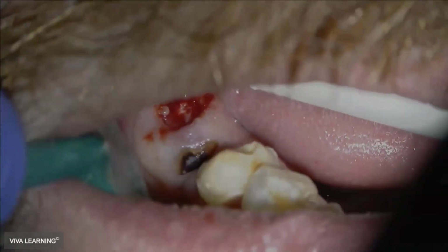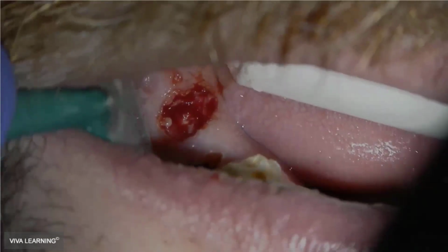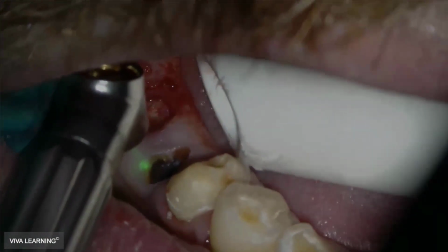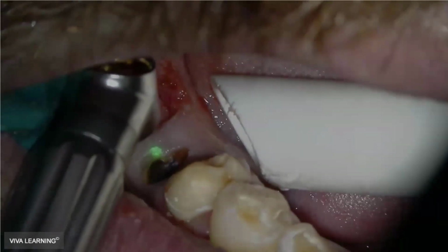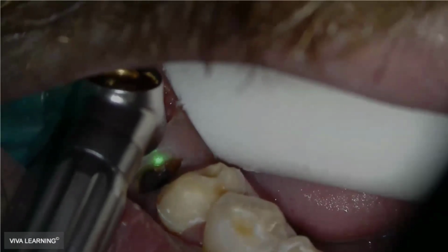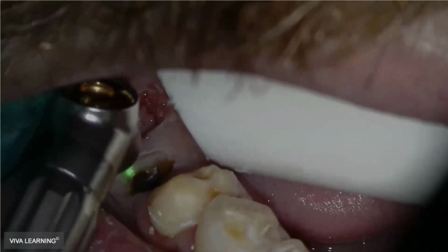this patient was numb for this extraction. Absolutely. Again, using the laser as an essential tool for what we're doing, even though if I'm going to stick an instrument in there and pull on that root tip, absolutely, they're going to need some numbing for that.